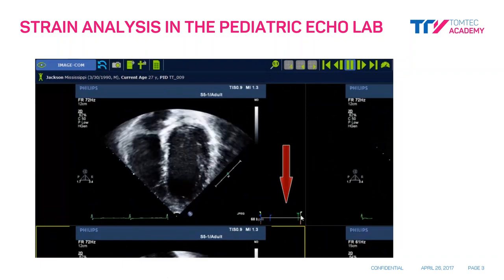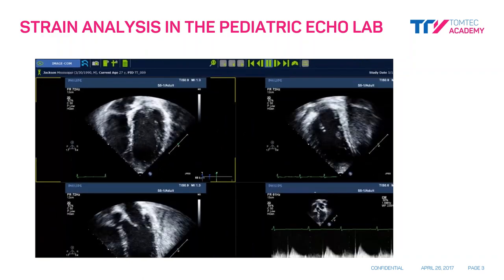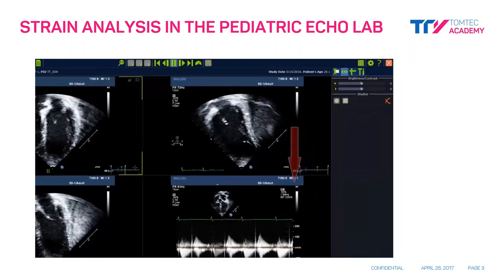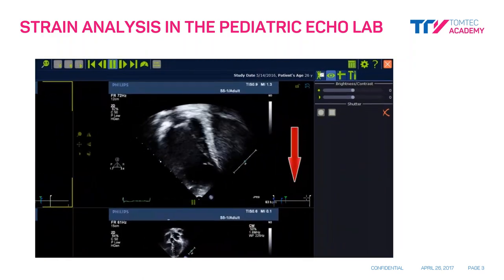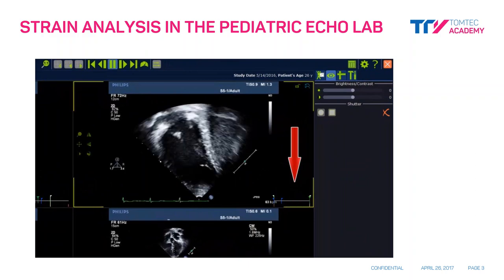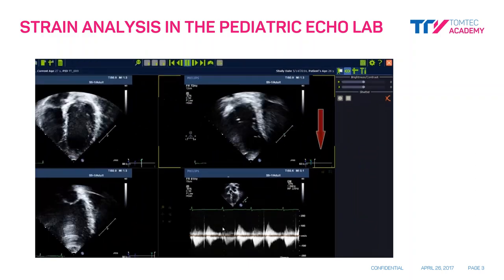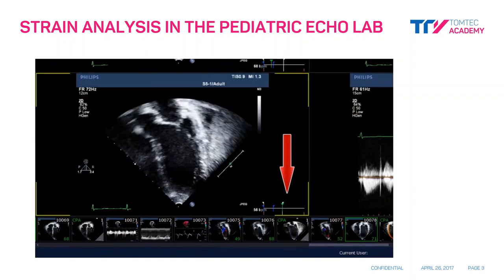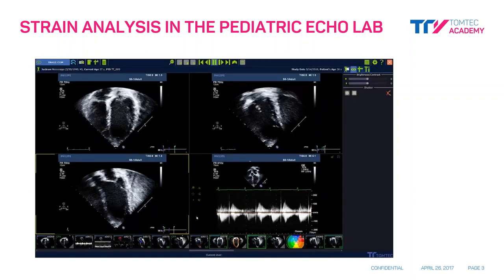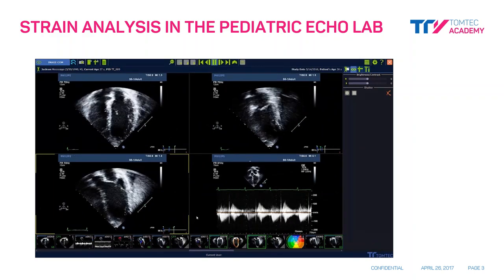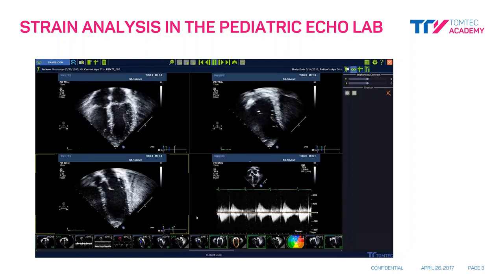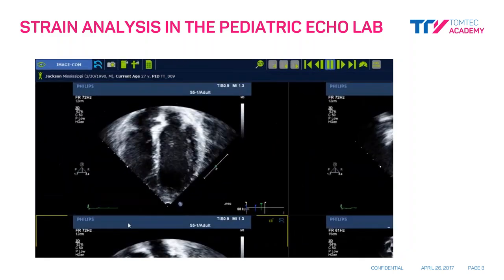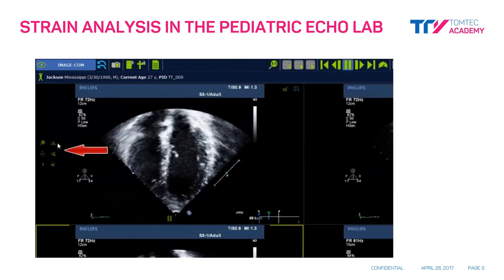By using a left click and drag and drop, the reference markers can be set to define any one beat cardiac cycle. Complete this same process for all of the images to be analyzed. Next, to account for the sector flip observed in most pediatric echo labs, the user will refer to the sector orientation keys located to the left of the images. We will begin by flipping the apical four chamber view.